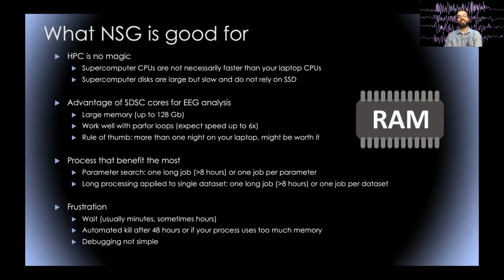Another use case is long processing applied to a single data set, so more than 8 hours on one data set. It's a good use case for using NSG. There'll be some frustration when you use a supercomputer. You have to wait. It's not instantaneous.